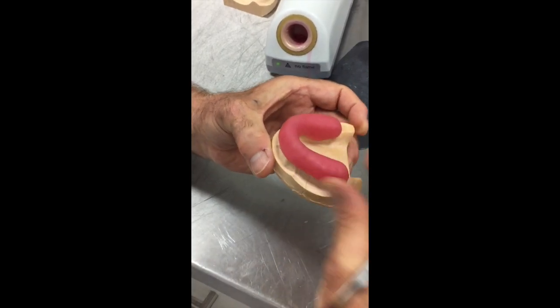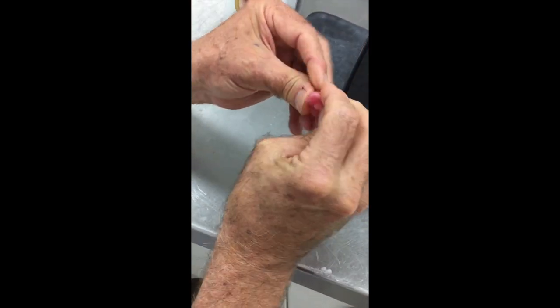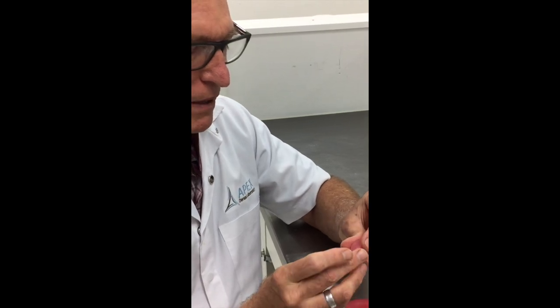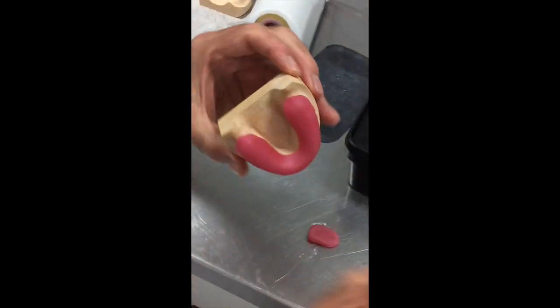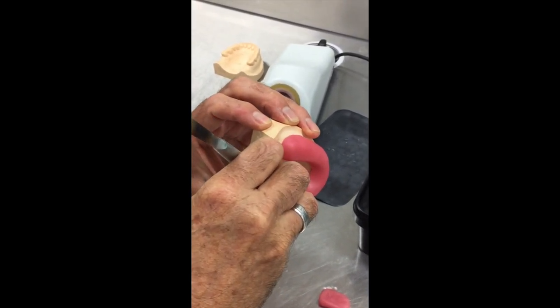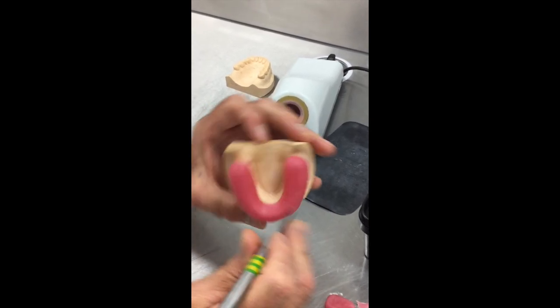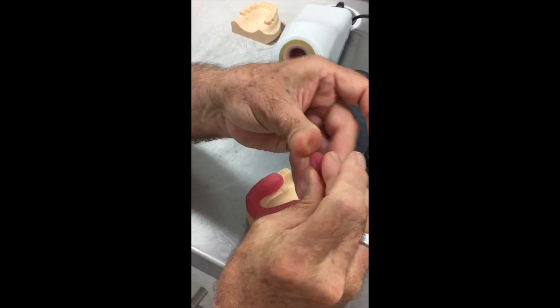Now, I like to think that we would spend time making these look neat, because these patients are going through quite a bit of time in the chair, and they're usually paying quite a bit of money for the procedure. So the more professional we can make these trays look in appearance, the more likely the patients are to be given the idea of professionalism and quality from the practitioner. So it's worth taking that bit of extra time, and we certainly do, to make sure that our trays are finished neatly, so that our clients can give off that professional aura to their work by presenting a tray that's nice and neat.